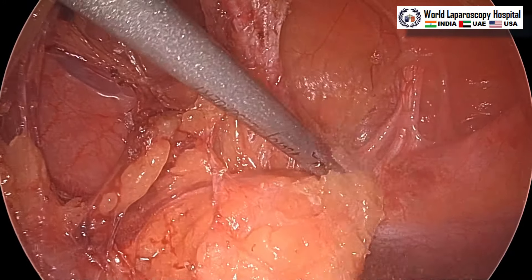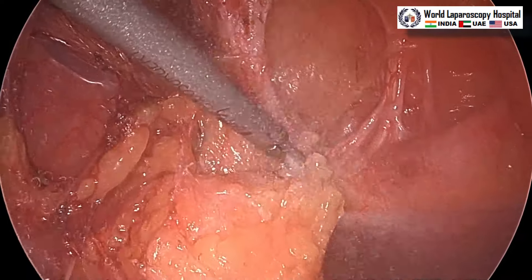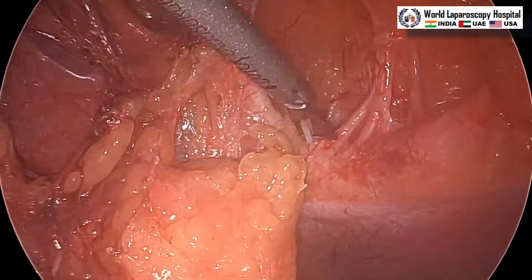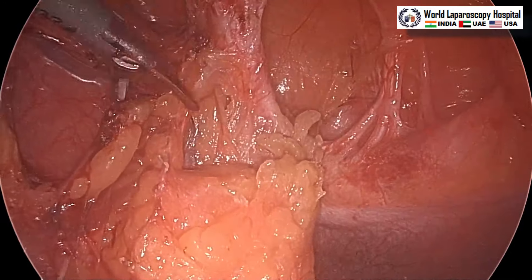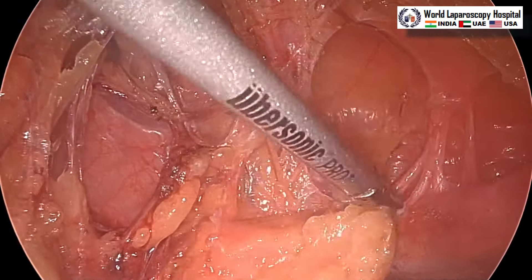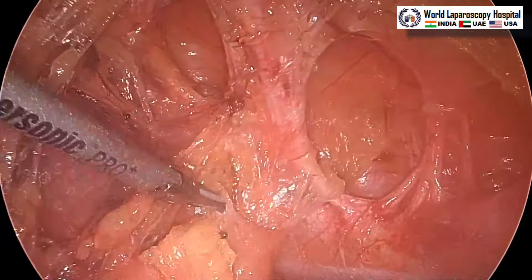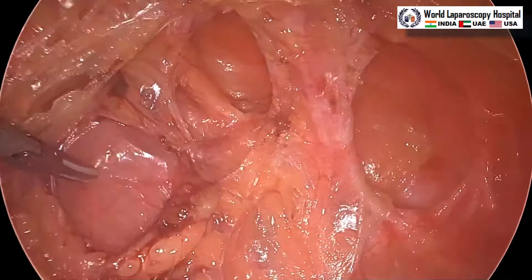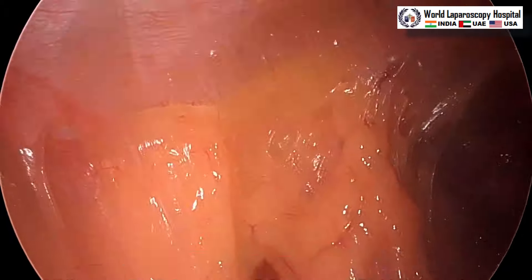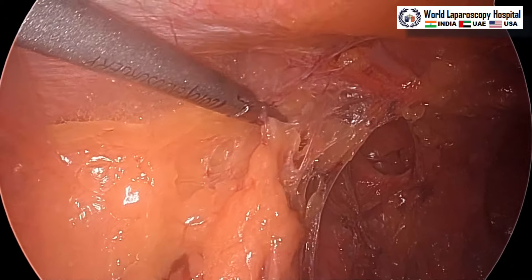Like in front you can see there are three hernias already visible and a couple more are down. For this type of hernia we will use titanium mesh — that is an extra very strong mesh. It is made up of polypropylene and titanium. This is a new mesh which I will show you later, once we will prepare the mesh. These meshes have the advantage that they are made for intraperitoneal application.